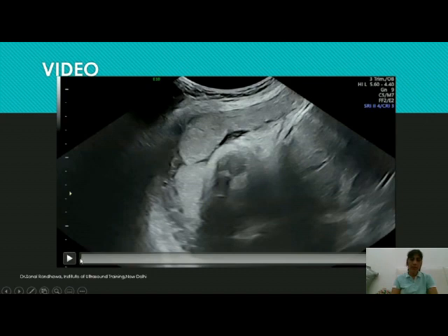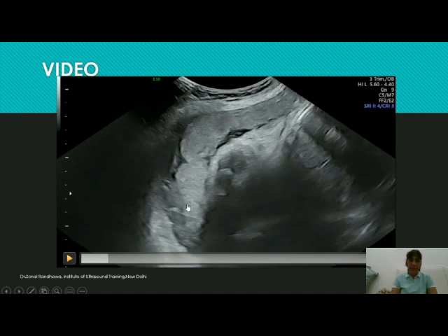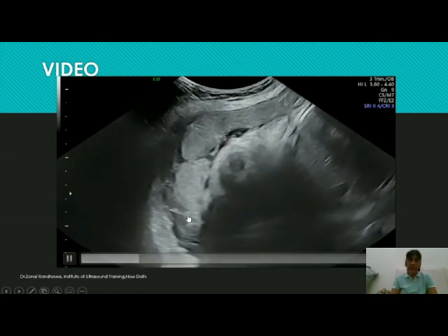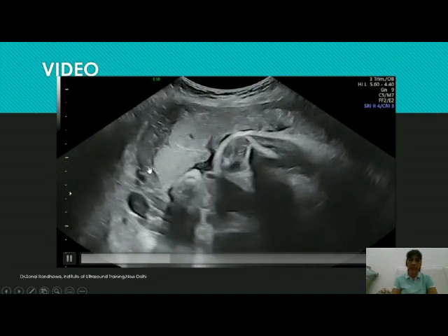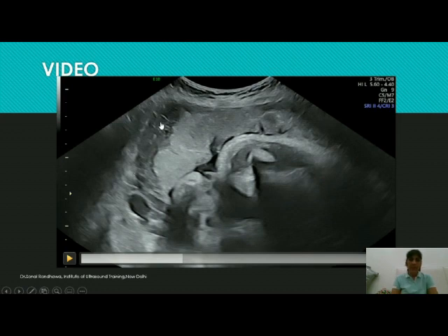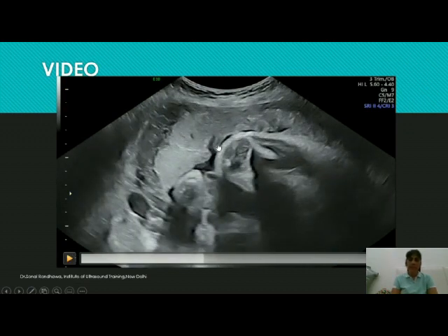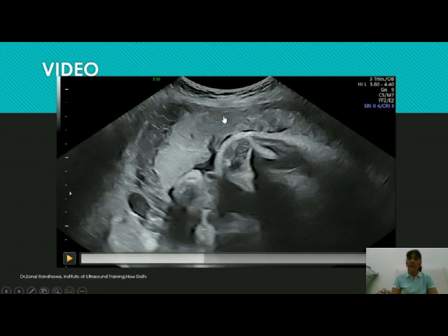Now let's look at the video of the same patient. The placenta is seen very well, and in the retroplacental area observe the perpendicular bands — multiple bright white bands passing through the dark retroplacental space. If you see such a thing, we would say this is placenta accreta. Now see further in this area.